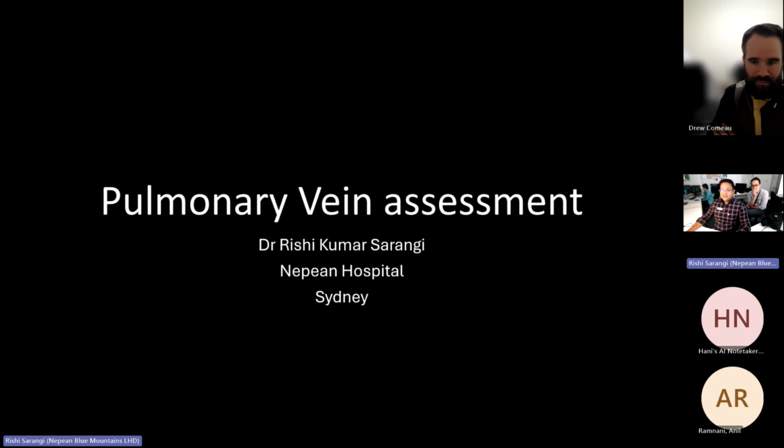So what we'll be discussing today is pulmonary vein assessment. The general outline is that we'll quickly try, within 30 minutes, to go through the relevant anatomy and some Doppler waveforms, and then we will practice some cases. I have a few interesting cases to go through, and the last one was given just this morning by the co-director of imaging cardiology. So that'll be good to go.